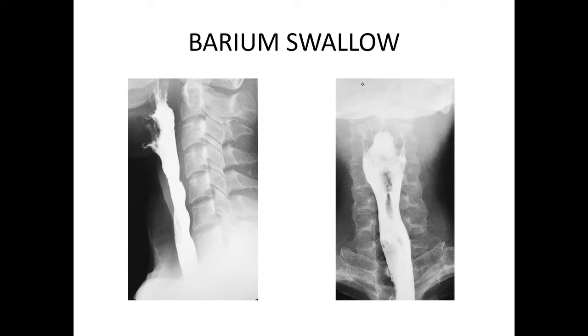So now the various barium series include barium swallow, barium meal, follow through, then barium enema.